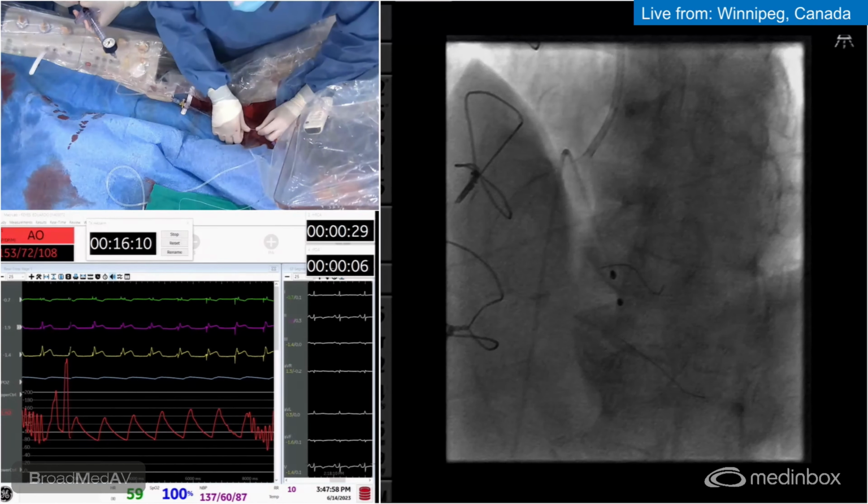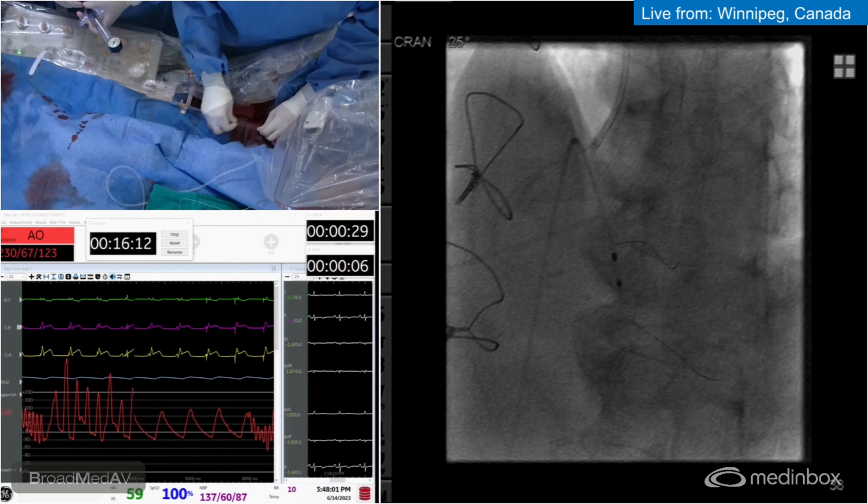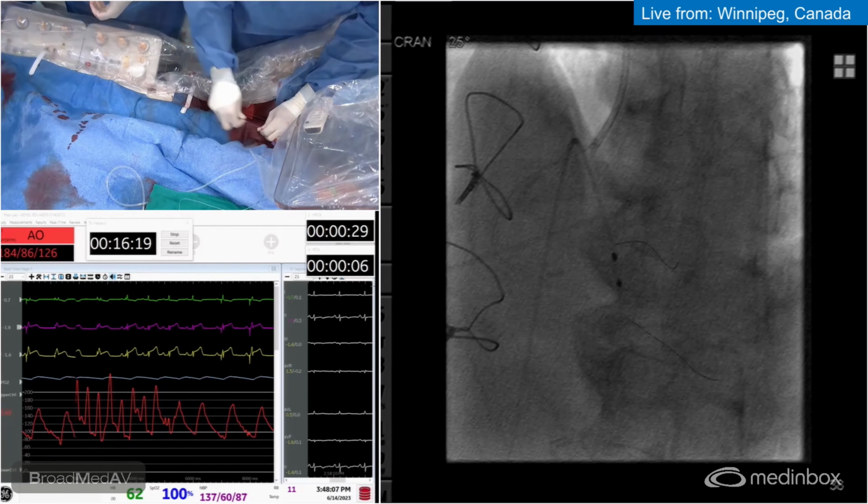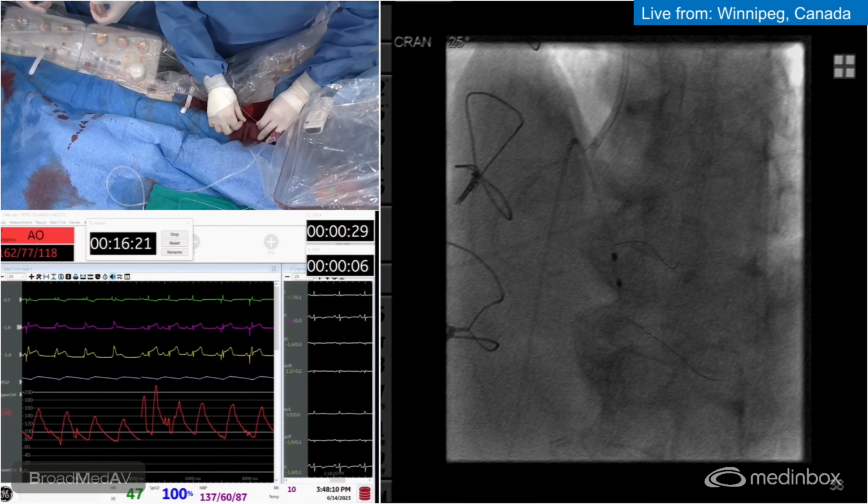Should we give adenosine or hold off for now? I think you don't need it. Sounds mostly good. We're not going to take the orbital down anymore, right? You want to take out the Viper? So we can take the Viper wire out because that's not going to be our next step.